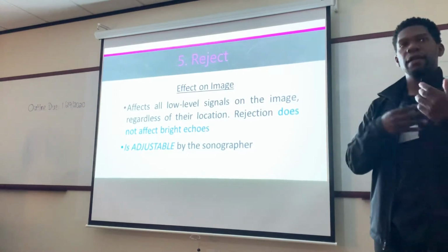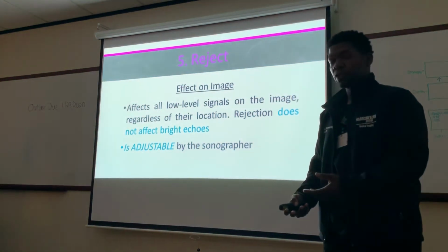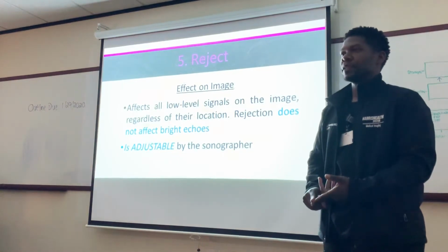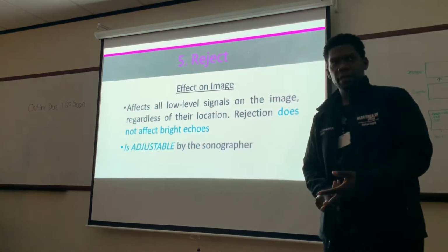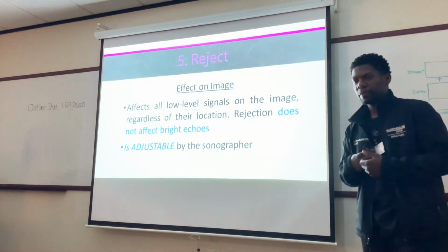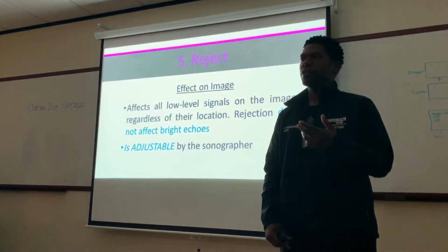You know, guys, I'm telling you this so you can start using these features, these tools, when you're working. You never see technologists adjust compression, really, right? You never really see them adjusting the threshold, the reject, right? But I'm all about using the machines to their full capability, if you ever work with me. You never had that opportunity to work with me in the clinic.